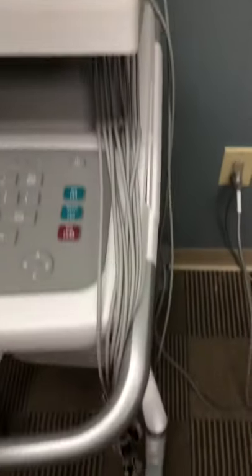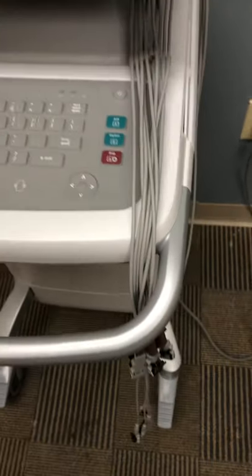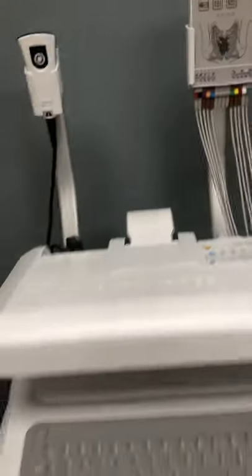The leads themselves are too long and they drag on the floor, so just throw them over the handle so they don't drag on the floor and potentially get ruined. Up top, there's also a barcode scanner that you can use to scan your patient's wristband when you get to that part of getting your EKG.